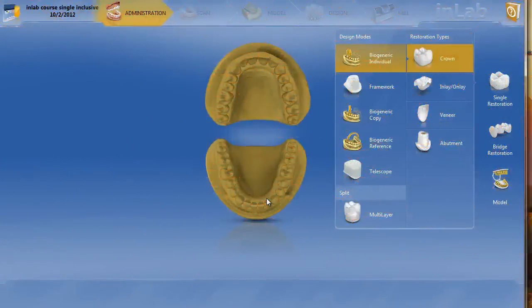In this video I'm going to show you how to use the Glidewell inclusive abutment to do a single unit screw retain crown.